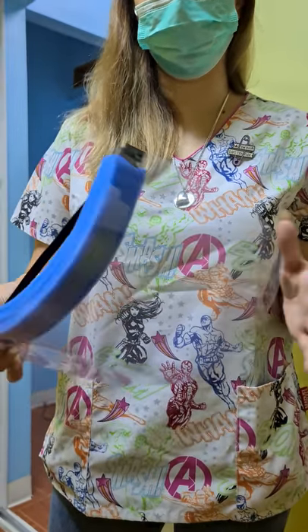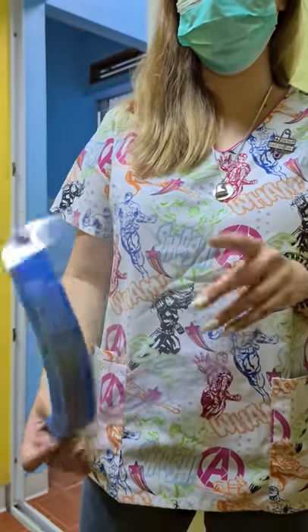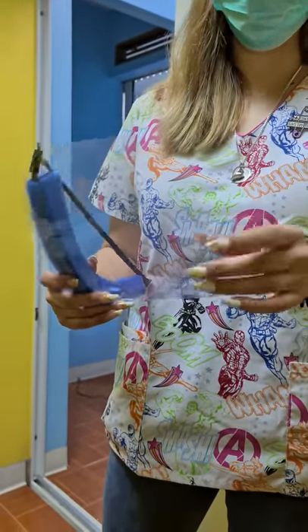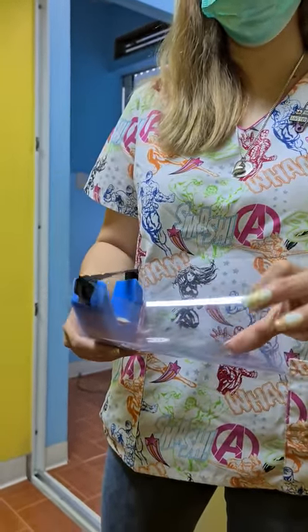Hi everyone. This is a quick tutorial on how we did our PPEs, our face shield. What we used is acetate or PVC covers that are a little thick.